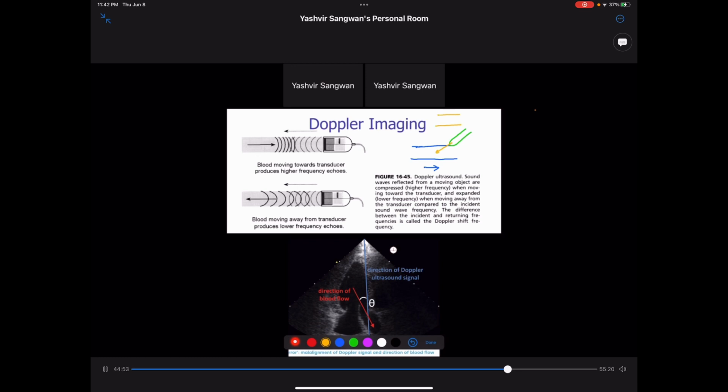Let's say you have an ultrasound which is right in the vessel. Okay? It transmits a sound at a certain pulse. That means at the same time, it is going boom, boom, boom, boom. Okay? So a sound wave comes out and it hits a red blood cell and then it is reflected back. Okay? That's good.